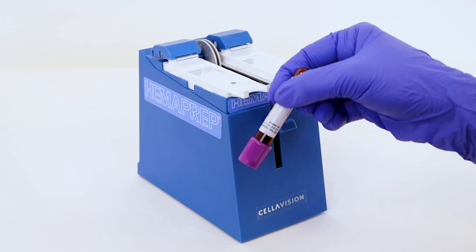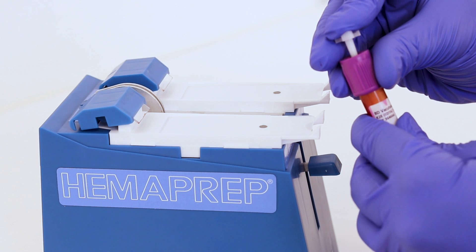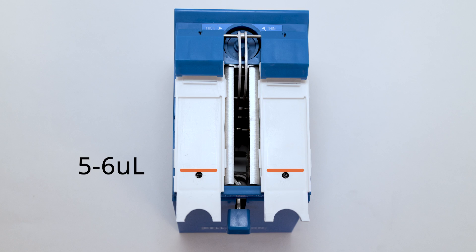Mix the tube and then use a blood dispenser or a pipette to place 5 to 6 microliters of blood at the top of the black dot.